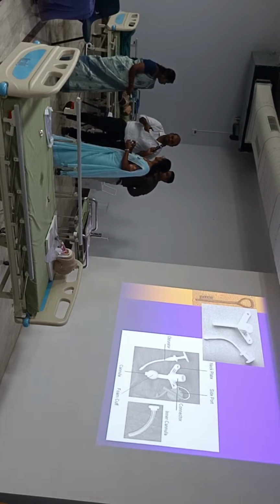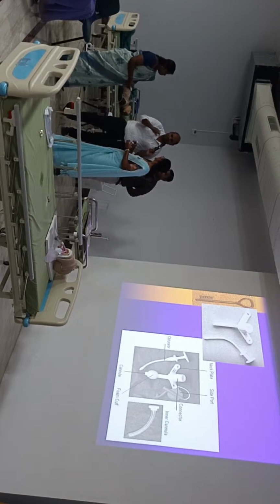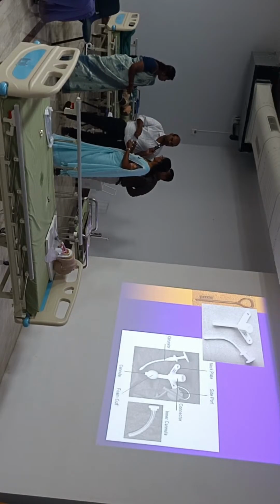It's a very fragile structure, the trachea. So the more pressure you insert, and the longer the cuff is on, the longer the blood supply will be cut, and the chance of tracheal stenosis will be high. You take the tube out, the trachea will collapse. So ideally 8 to 10 ml. Okay, and I'll later tell you how to deflate the cuff and do suctioning also.